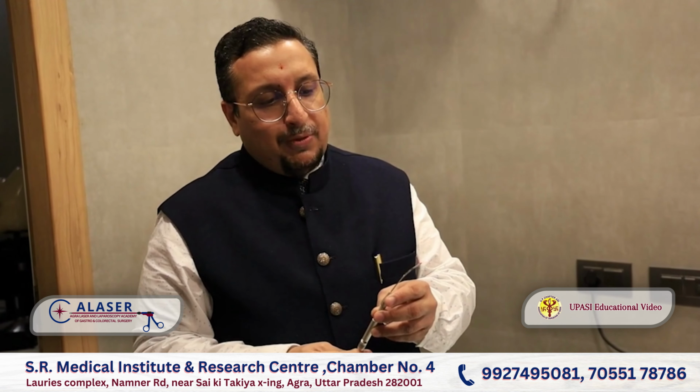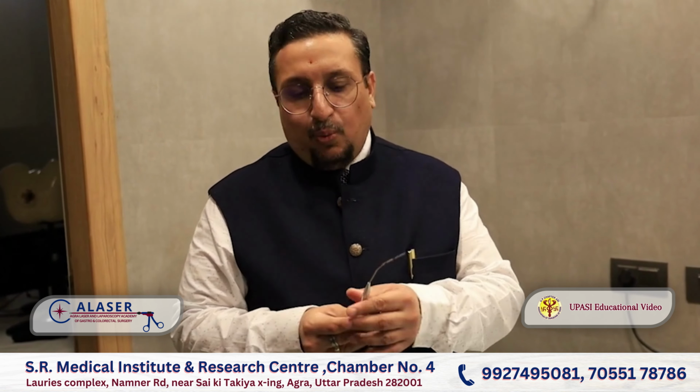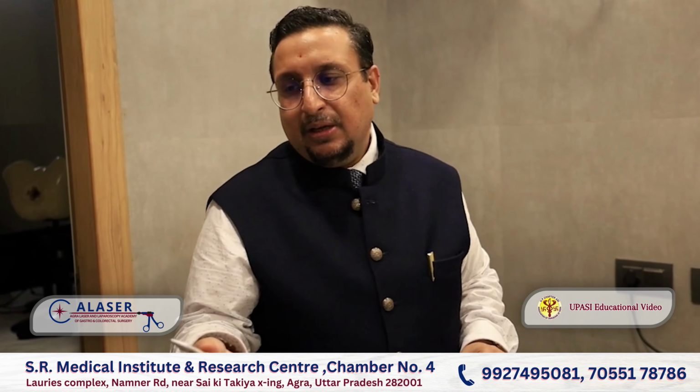So ideally it should be 1 to 2 millimeter out only, not more than that. Can anybody tell me why I am not keeping this much length? Any guesses? Can we keep this much length and do the surgery also? What is the problem? Why am I telling you to only keep 1 or 2 millimeter? Any practical reason you can think of, if I can do surgery by this also? Why am I not asking you to keep it out 5 mm, 6 mm? Why?